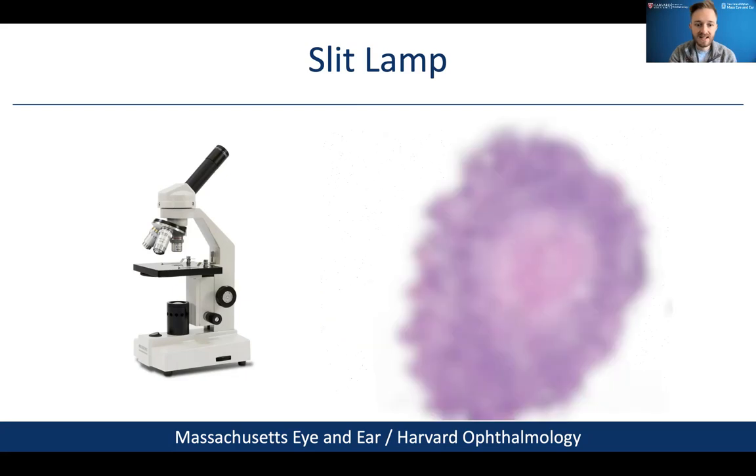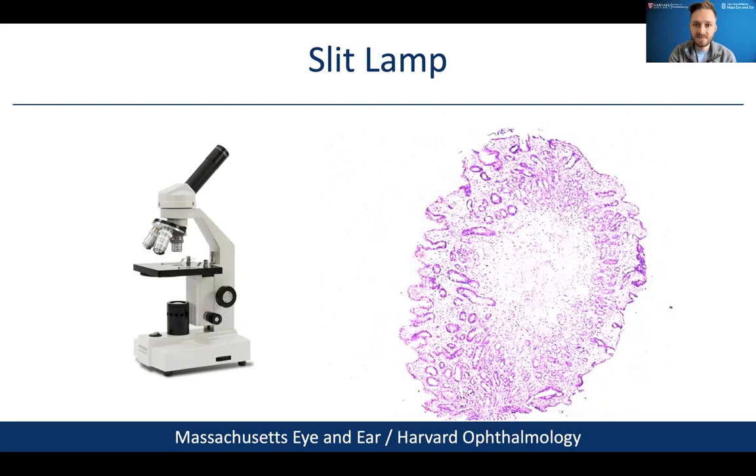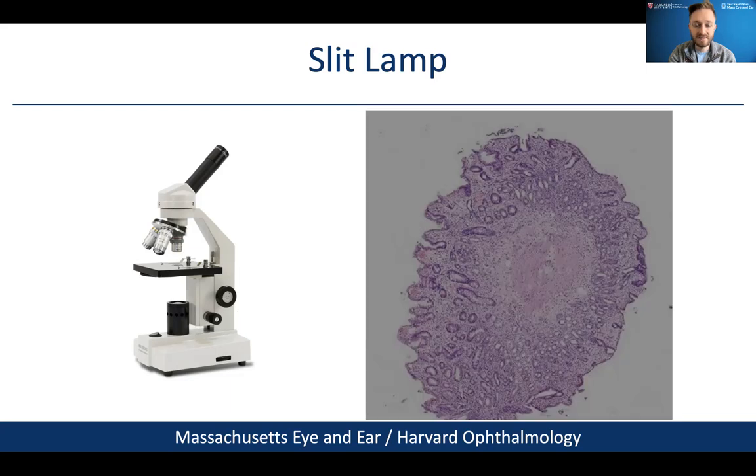Now, if you're looking at that slide underneath a microscope and it's out of focus, what do you do? Well, it may seem obvious, but you turn the knob so that things come slowly into focus. And so that makes sense. We need to focus the image. But what about brightness? Let's say that the image is overly saturated with light. Well, if that's the case, we turn the knob to decrease the brightness. If we go too far, then it gets too dim, and so we turn the knob the other way. And so we control the brightness level as well.